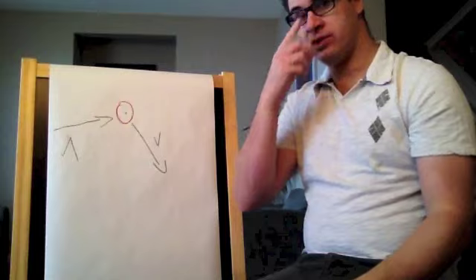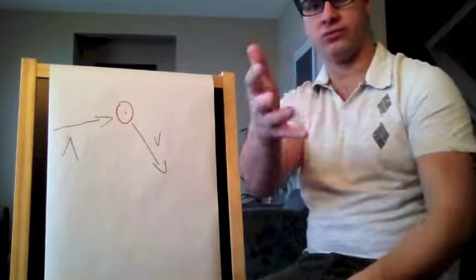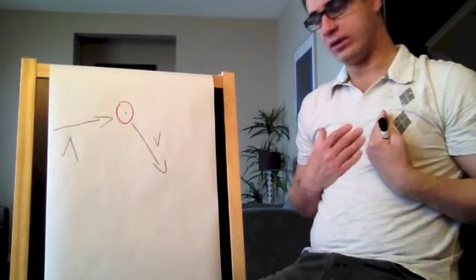So after that, it's to understand where the lead is, and that way you can almost make your own 12 lead ECG by understanding that concept and where the electricity travels. If the electricity is going towards me, it's positive. If it's going away from me, it's negative. This is the most important rule, because it's the basic of 12 lead. If you understand this, even if you don't exactly know what's going on in 12 lead, you'll be able to explain a little bit more where the electricity is going.